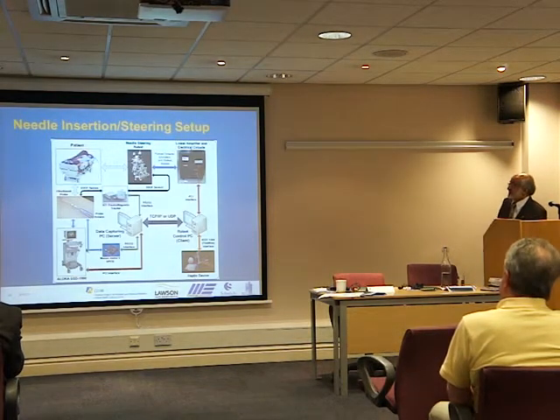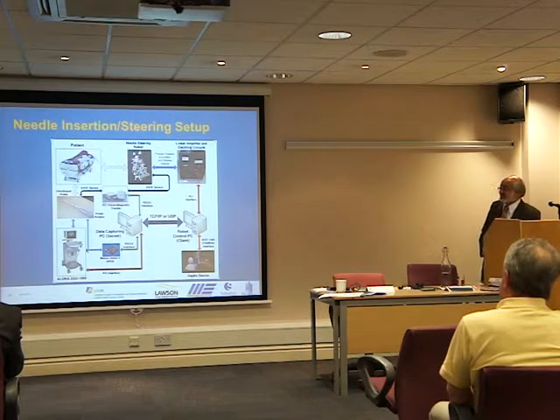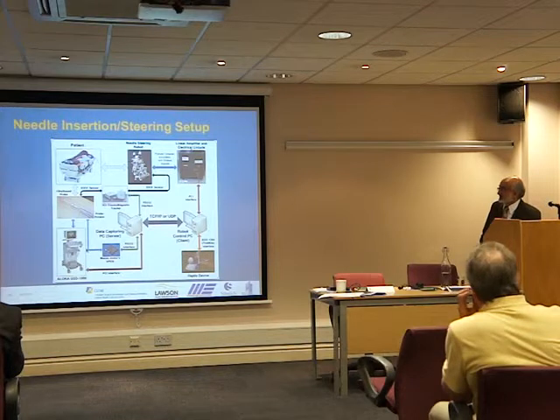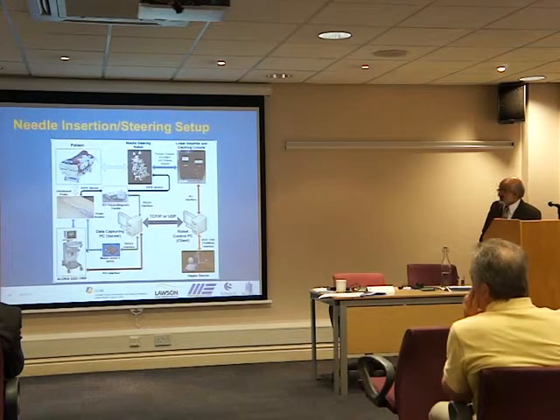So this is the total layout of the system. As you can see, it's a fairly complex system which involves imaging, control. It also involves a haptic device for insertion of the needle so that the clinician can feel the force.